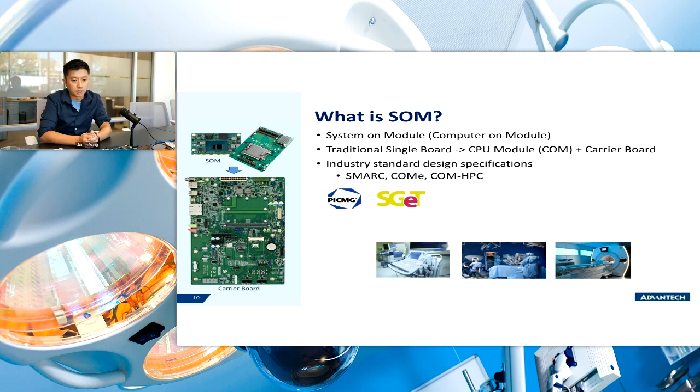There's two commonly seen committees in charge of the different standards for system on modules. So there's PICMG and then there's SGET. PICMG is going to be responsible for your COM-HPC and your COM Express standard. And then SGET will be responsible for SMARC and Q7 standards. Just so you guys know, Advantech is on both of these committees.